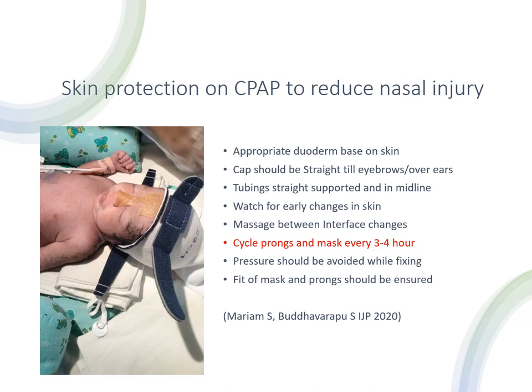The cap should be straight and it should be pulled over to the eyebrows and over the ears. The nasal tubings, the interface tubings, should be supported and they should not be too tight. Watch for early changes in the skin, so every 3 to 4 hours we take off the Duoderm and check how the skin is, and we do some gentle massage of the skin between the interface changes.